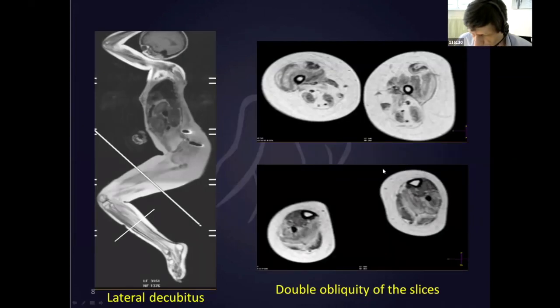In case of severe retraction, lateral positioning and reorientation of the slices permitted us to obtain a comprehensible anatomy. It is very difficult to interpret images with huge deformities, and you have to have a good comprehensible anatomy. So you have to adapt to the clinical situation.